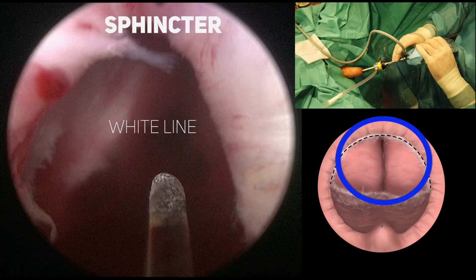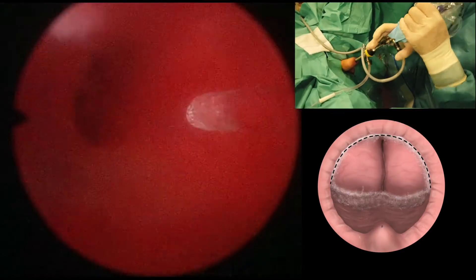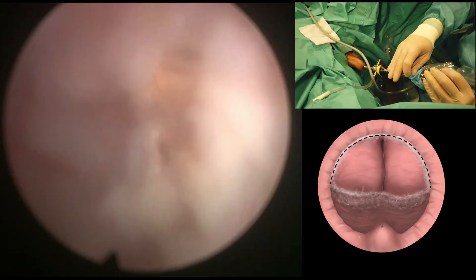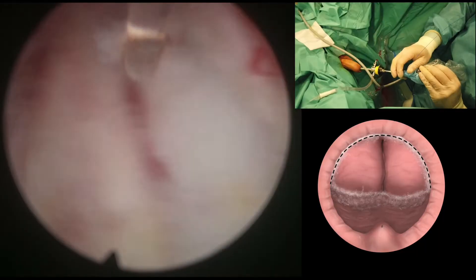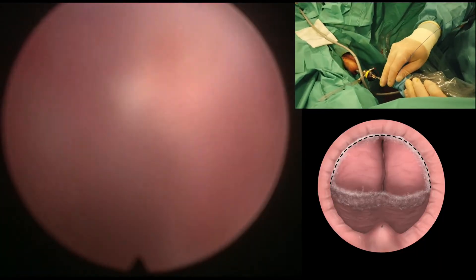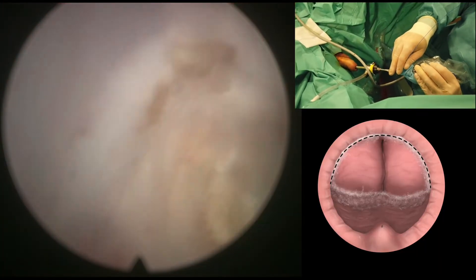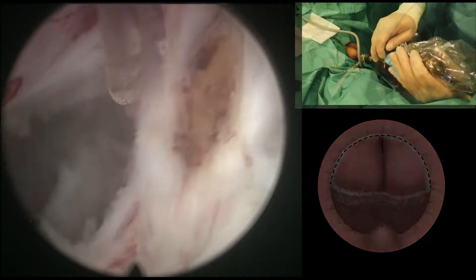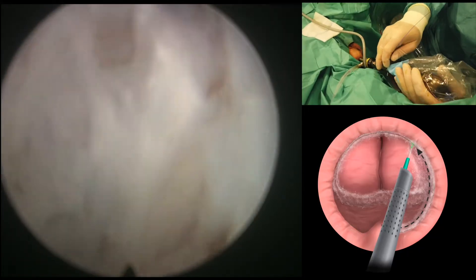Here you can see that the sphincter has been preserved. The white line is a little bit more inside and now we're going to start with the apical dissection. For that, and in order to release the sphincter from the adenoma, we have to cut a little bit at the edge — like deepening the white line that we marked at the beginning — even cutting a little bit on the adenoma.